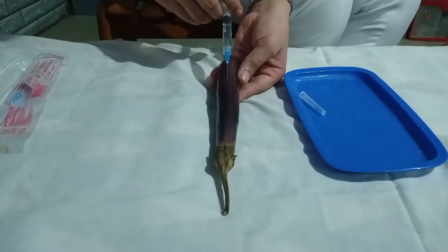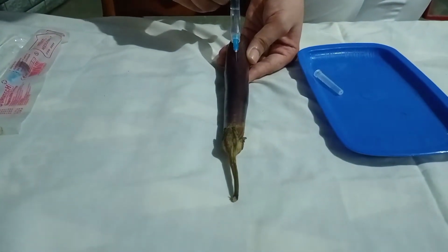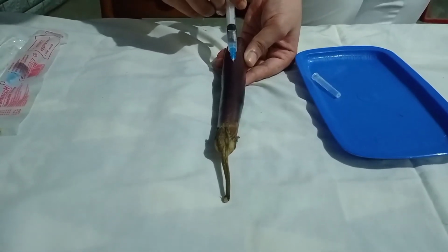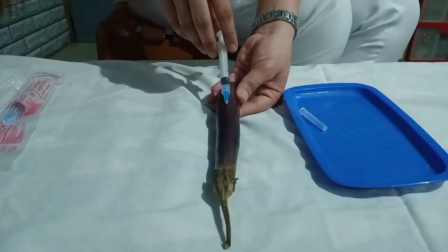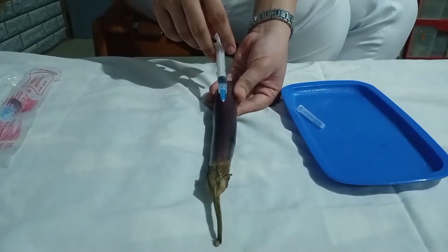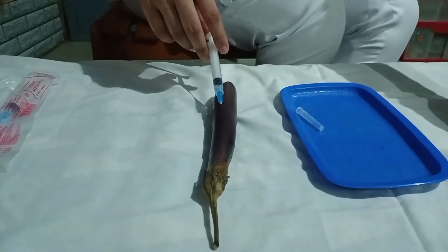flatly so that the point of the needle can be seen through the skin, and slowly release the medication. Stabilize the syringe and needle and inject the amount of the solution that has been prepared already. The rationale for that: if a small wheal appears, all the solution is in the intradermal tissue. Next, I'm going to remove the needle.